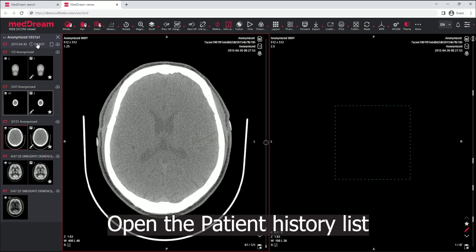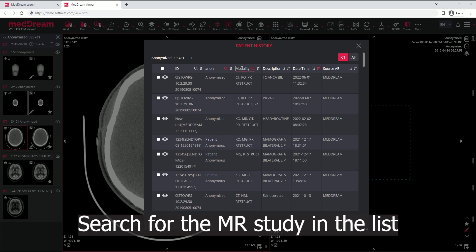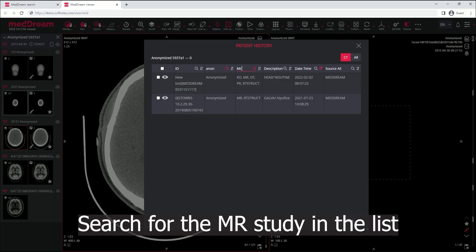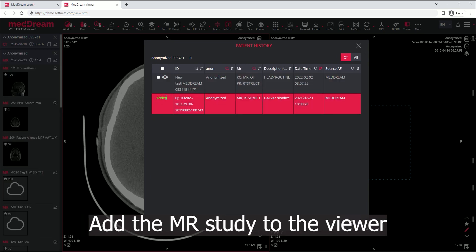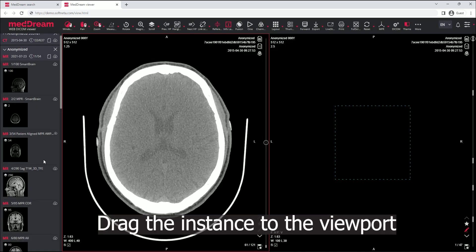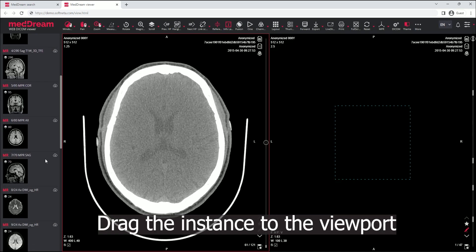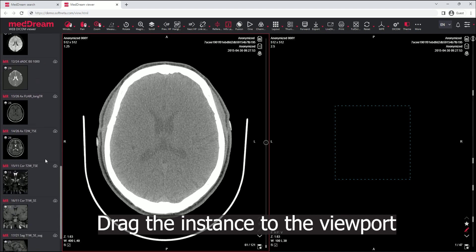Open the patient history list of the same patient. Search for the MR study in the list and add the MR study to the viewer. Drag the instance to the viewport.